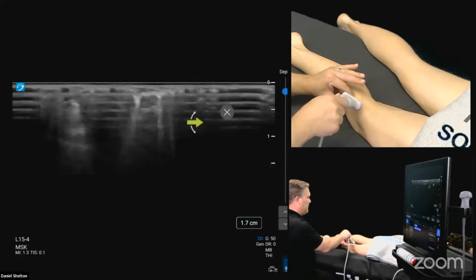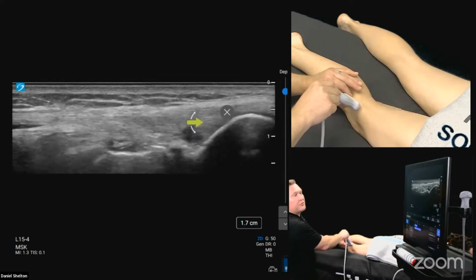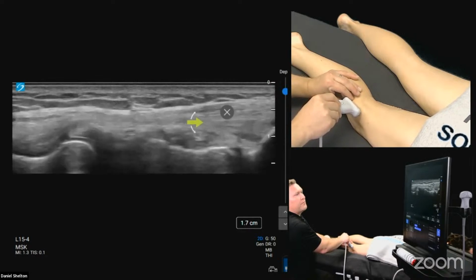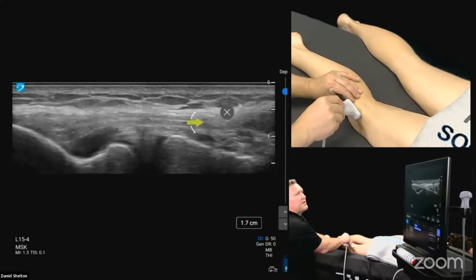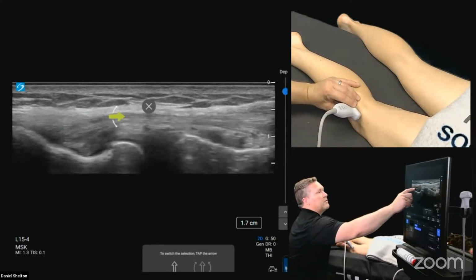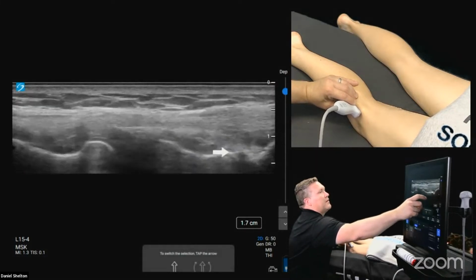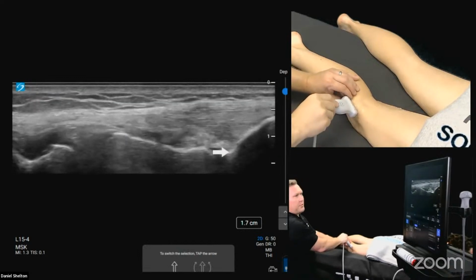That's screen left. I'm going to flip it. All right, so left side of the screen is proximal, right side is where my fingers are pinching. If I'm anterior, I get an LCL across the screen, jumping over the popliteal groove to the lateral epicondyle. Everybody appreciate that? So what I can do is just drag my arrow across here. Here's LCL, popliteal groove of the femur, joint line, tibia, and then fibula up here. If you have that shot, you're not posterior enough.